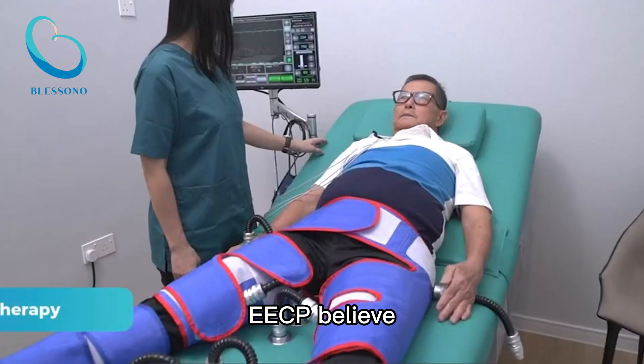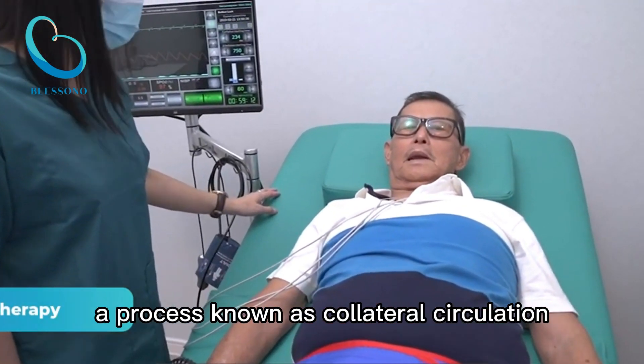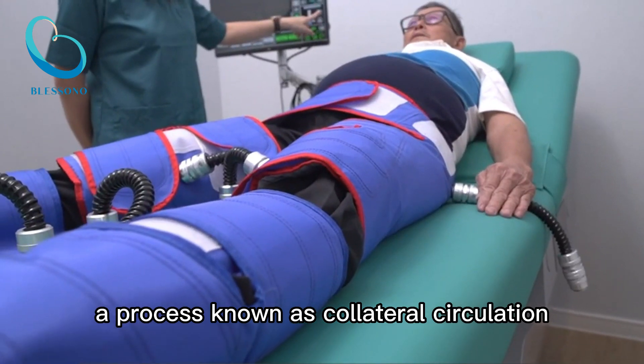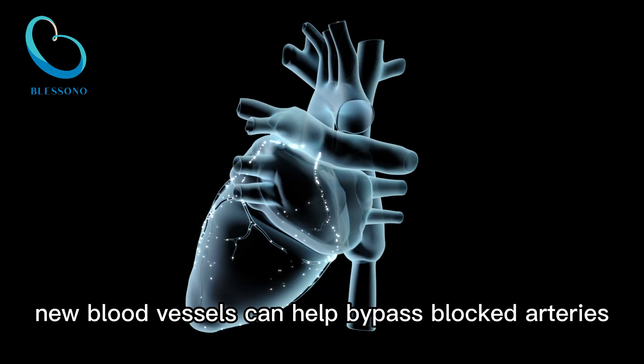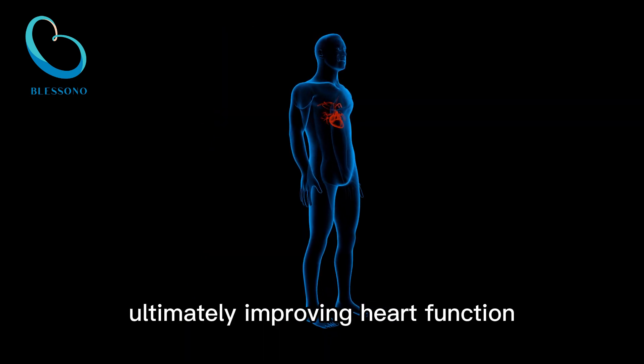Collateral circulation. EECP is believed to stimulate the development of new blood vessels, a process known as collateral circulation. These new blood vessels can help bypass blocked arteries and further enhance blood flow to the heart, ultimately improving heart function.